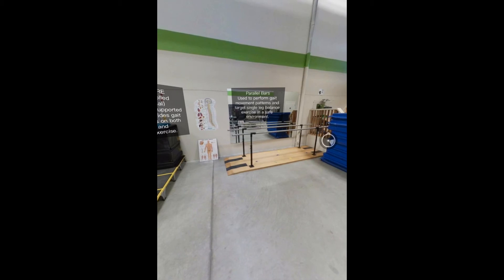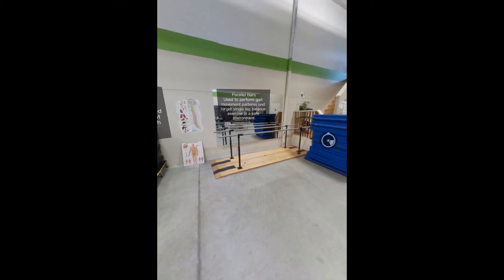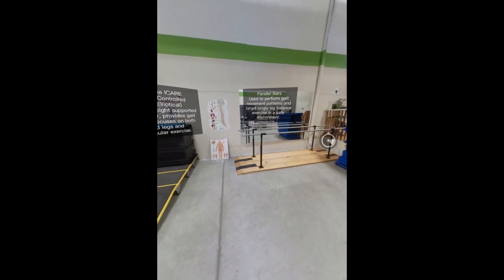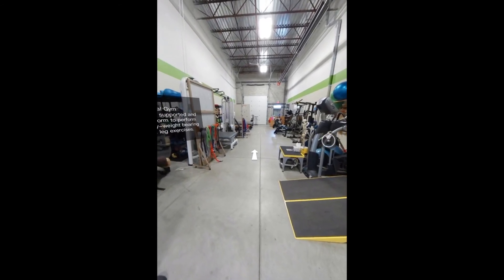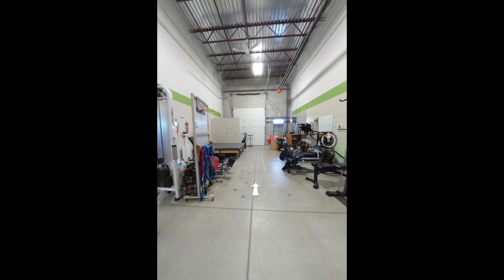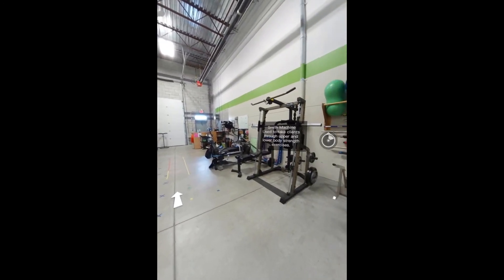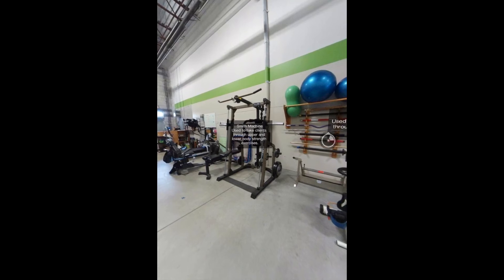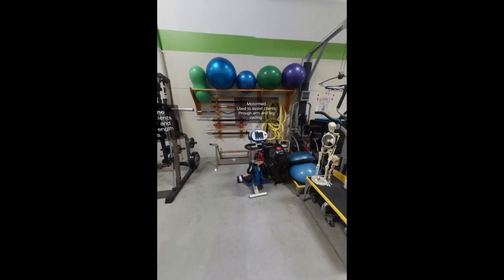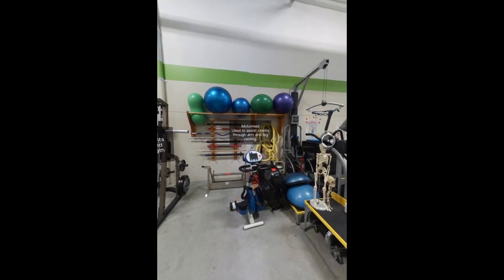The parallel bars are used to perform gait movement patterns and target single leg balance exercise in a safe environment. The Smith Machine is used to take clients through upper and lower body strength exercises. The Motor Med is used to assist clients through arm and leg cycling.